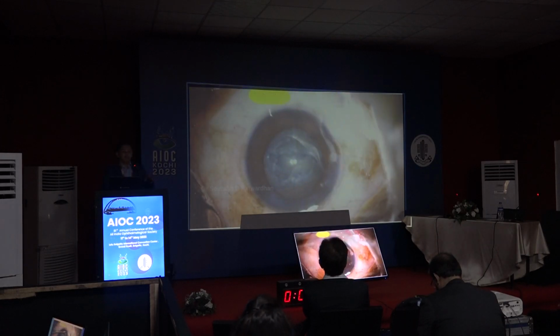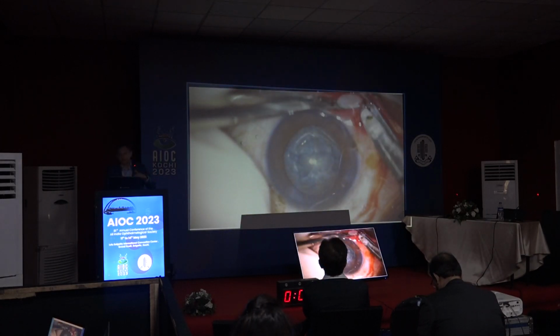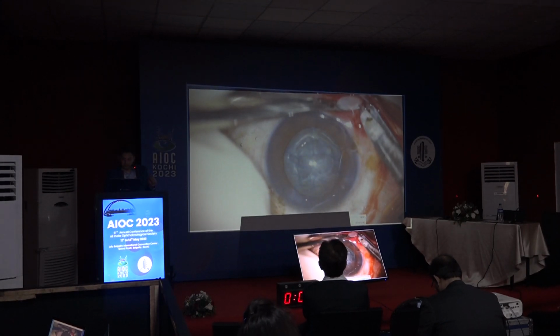Now the second part I am going to show is converting into the scleral SICS tunnel. Okay, first thing, make the patient very comfortable. If you have a complication, just give a posterior subtenon block. It's very easy. First I think I will just re-show.